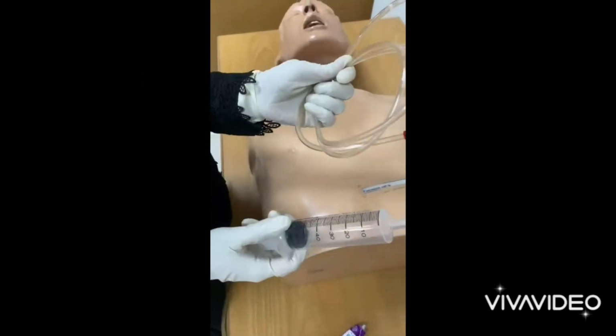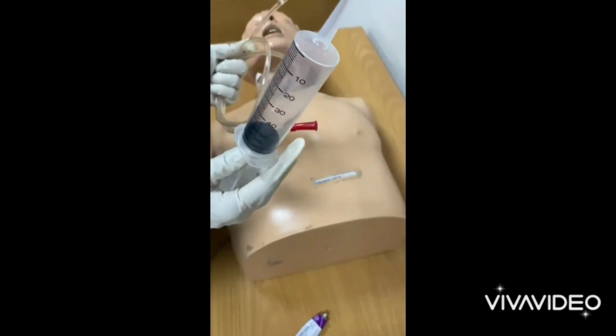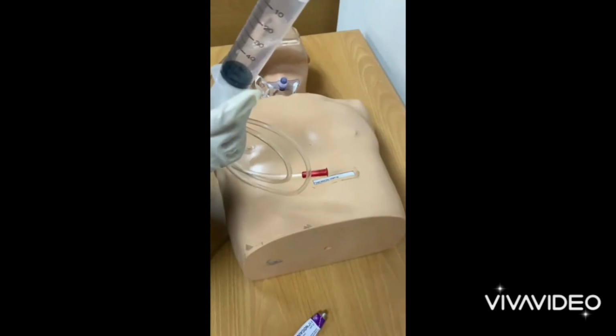Bismillahirrahmanirrahim. This is the NG tube. This is its gastric end and this is the nasal end. This is the feeding syringe. It is up to 60 ml.